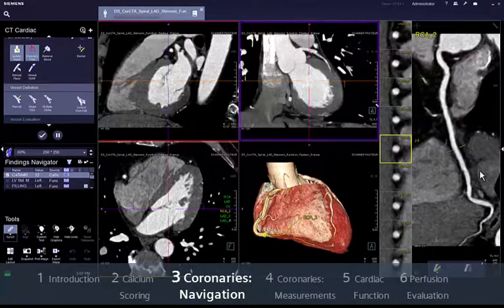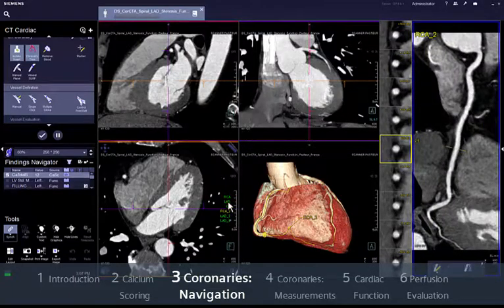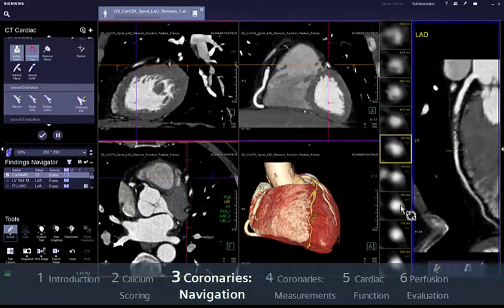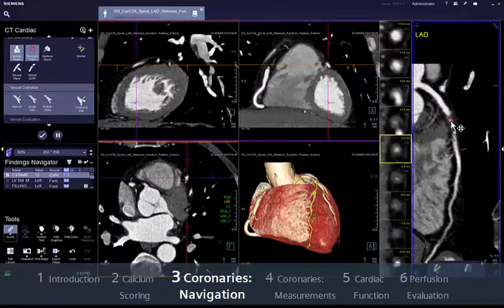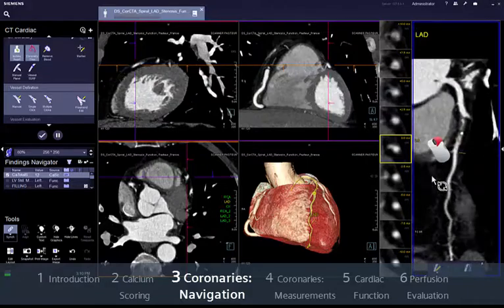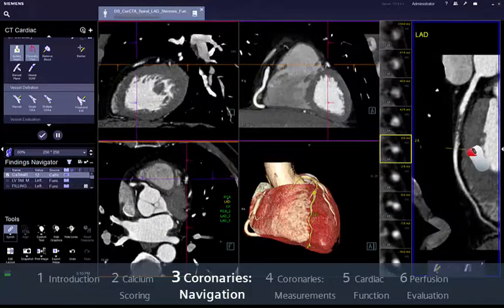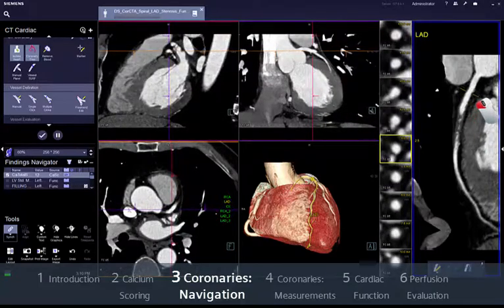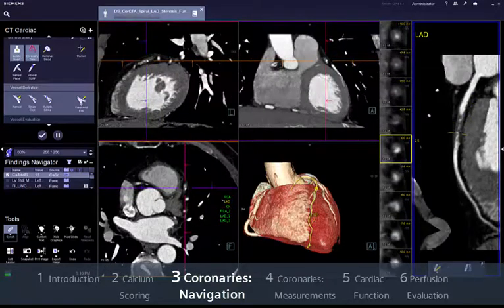The coronary arteries and grafts which have been automatically detected are labelled and displayed as a CPR on the corresponding segments, thereby speeding up your evaluation. This view provides an overview of the complete path of the vessel and its lumen in a longitudinal view and a cross-sectional view orthogonal to the centre of the vessel. Simply drag your right mouse button horizontally over the CPR to rotate around the axis, or drag the yellow reference over the vessel to navigate along it. The cross-sectional segments update as the yellow reference moves to indicate the position of the framed segment.